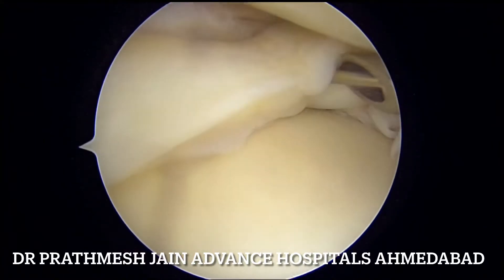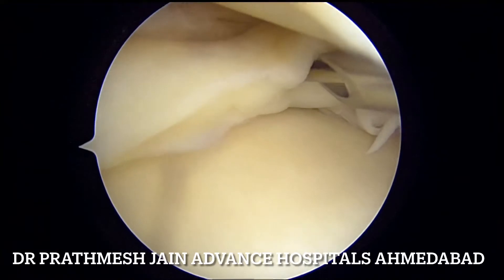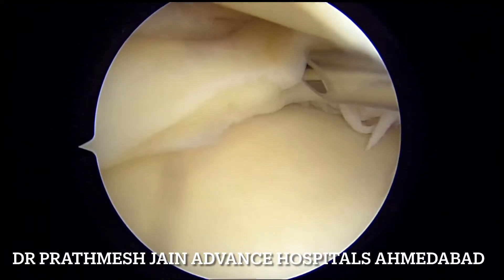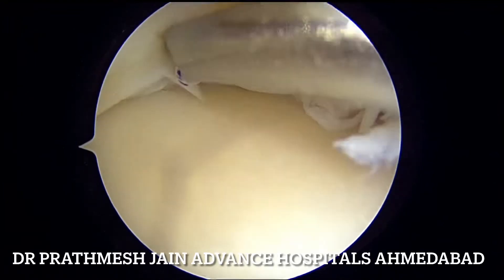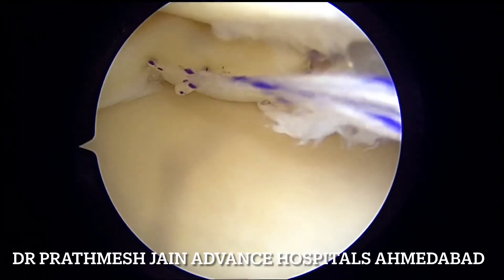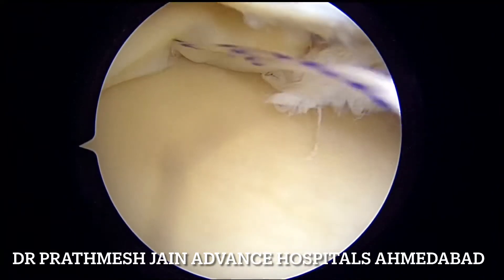We start by putting a traction stitch using the inside-out technique. We will use the first stitch in an inside-out fashion with a double cannula and two needles, using this as a traction suture to reduce the bucket handle anterior component into its place. Once this stitch is placed, the medial meniscus is reduced.